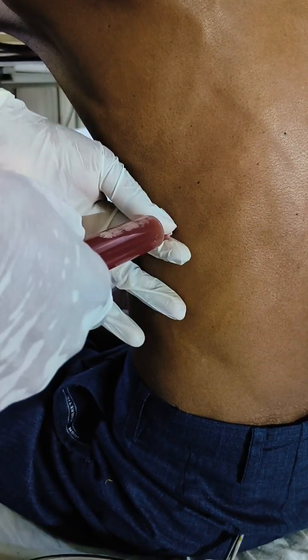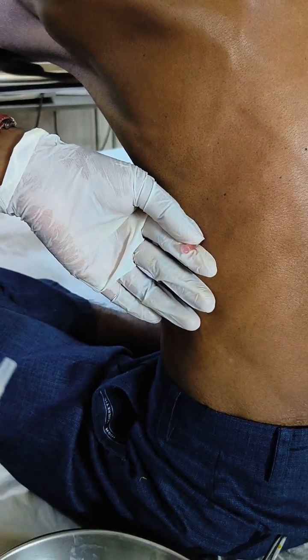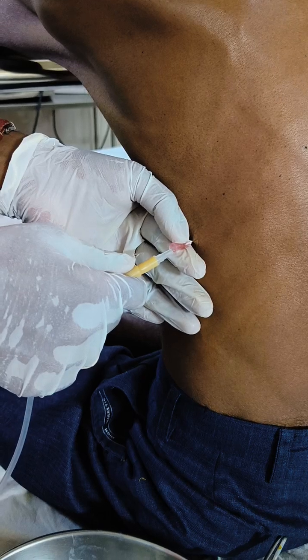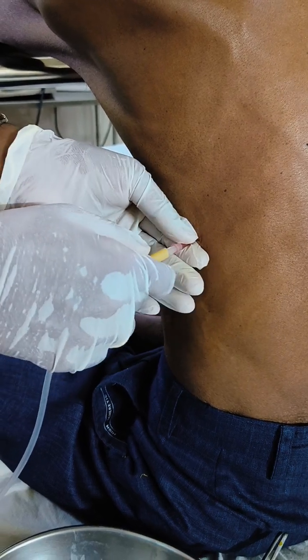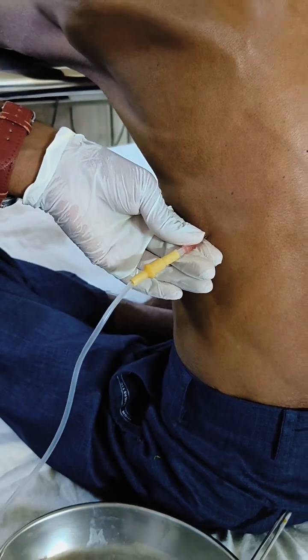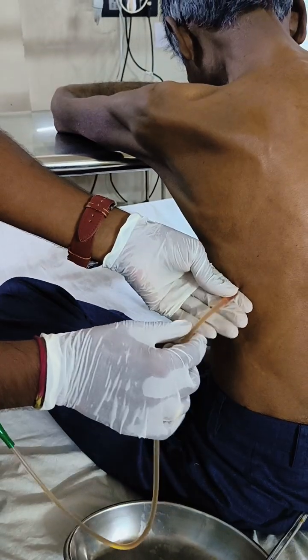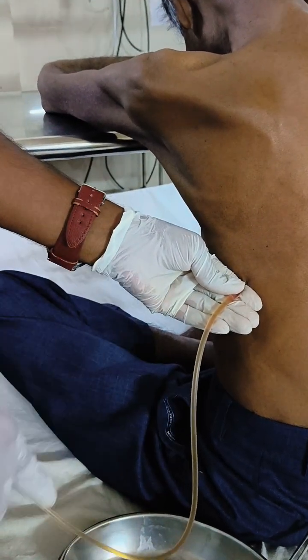So what you have to do is use the suction machine. We are starting from the suction machine. The fluid is coming now.